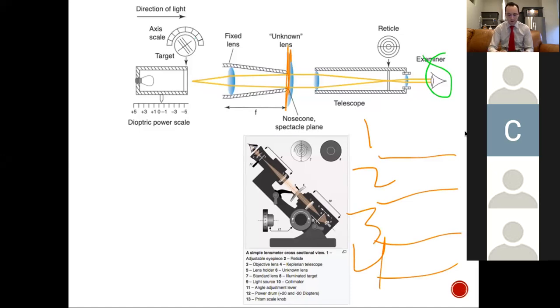And so we want to go ahead and set a piece of paper here in the area where the lens stop is, okay? And when we look into the device, we see this reticule, right? Essentially, what we want to do is adjust the ocular here so that we have a clear image of the reticule, okay? So another thing of note would be this area right here, okay?